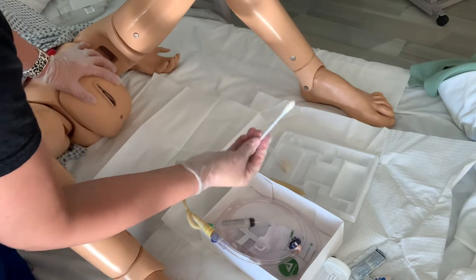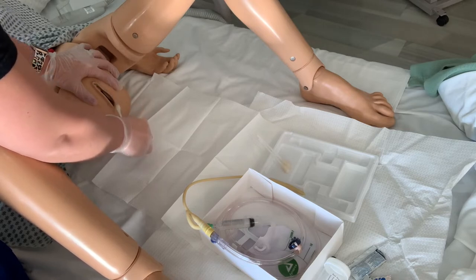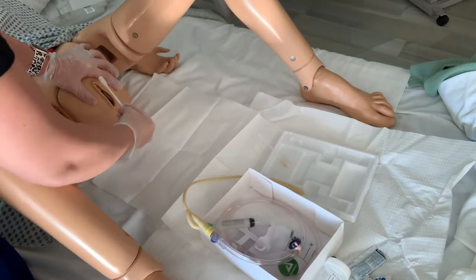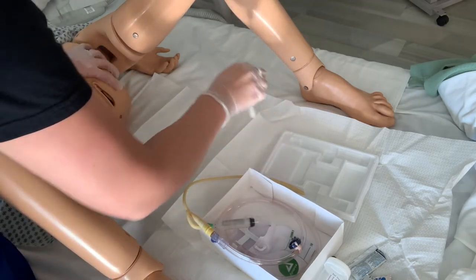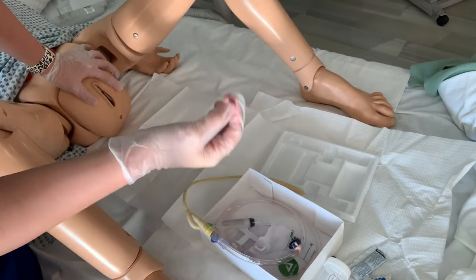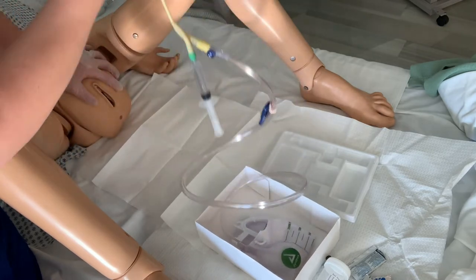I've got my labia minora spread. We're going to go one swab to the far side, take it away from my sterile field and drop it into the trash. Go to the near side with one swab, take it away from my sterile field and drop it. Then go once down the middle, swab, away from my sterile field and drop it. Remember, we're not dropping our arms below our waist. I'm always swiping from top to bottom, and do not place the dirty swab stick back into your sterile field — that's a second try.